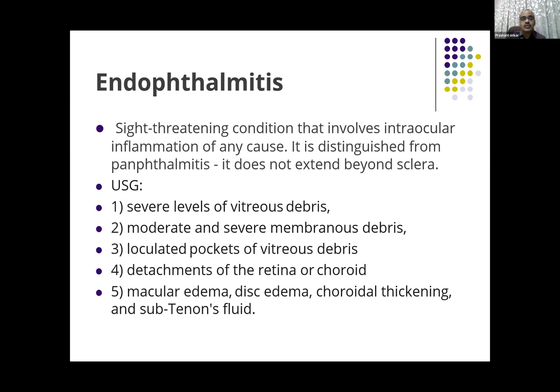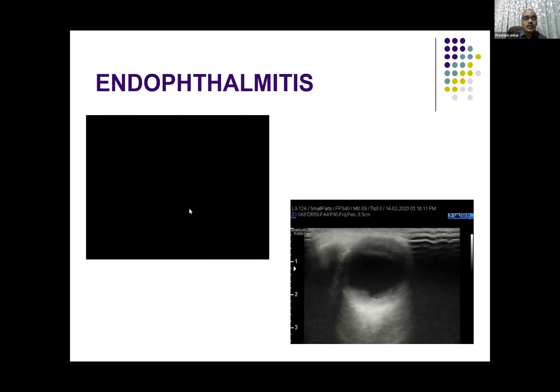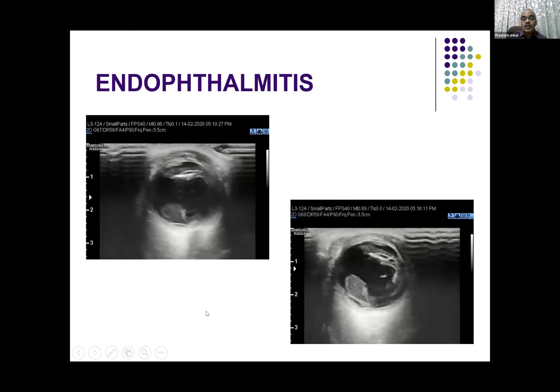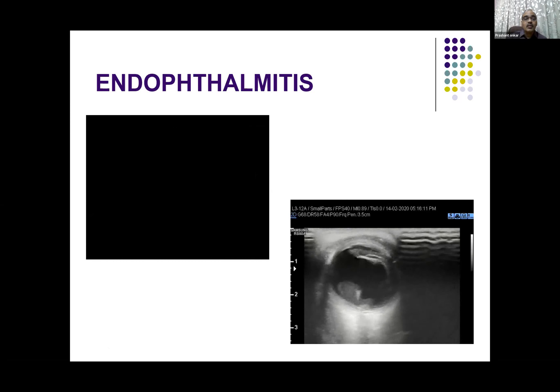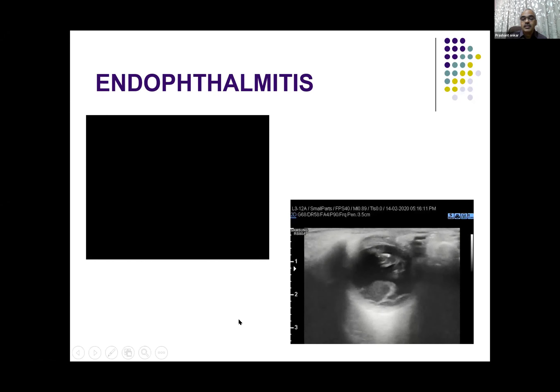Endophthalmitis is a sight-threatening condition involving almost all layers of the eye. It is distinguished from panophthalmitis in that it does not extend beyond the sclera, and ultrasound can differentiate that. Because there is severe inflammation, you will see debris, detachments, edematous areas, thickening, and fluid — all these findings can be seen beautifully on high-resolution ultrasound. This is a post-operative case of endophthalmitis where you can see internal echoes in the anterior chamber, the lens pushed to one side, and a lot of exudate membrane in the posterior chamber as well — almost all membranes involved. You can see membranes in the posterior chamber as well.